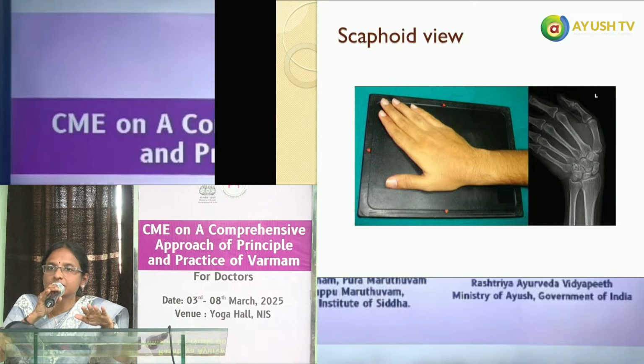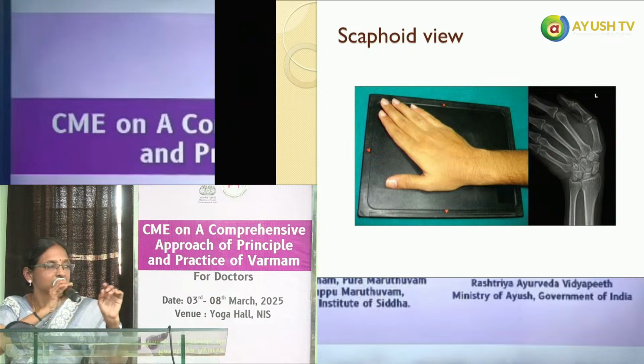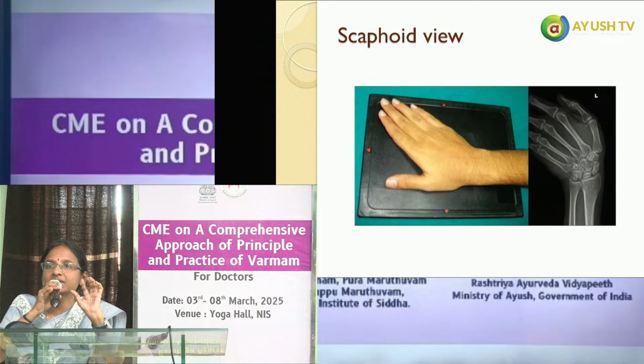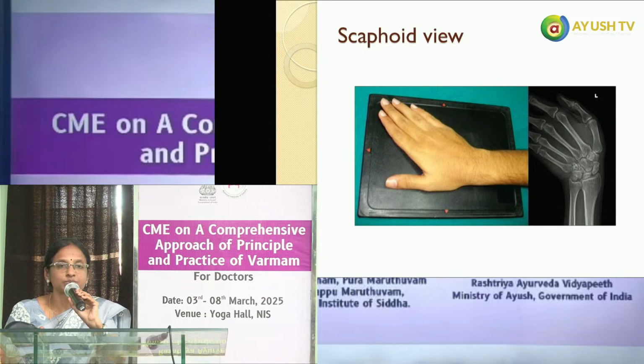So normally எடுக்கிறதுக்கு பதிலா ulnar side வந்து hand கொஞ்சம் deviate பண்ண வச்சிட்டு then we can take a view. So அப்படி எடுக்கும்போது the other side ல இருக்கிற scaphoid bone நல்லா it will come out very well. So scaphoid ஓட waist லையா body லையா fractures இருக்கான்னு பார்க்கிறதுக்கு this view will definitely help. So this is one other importance of a special view.